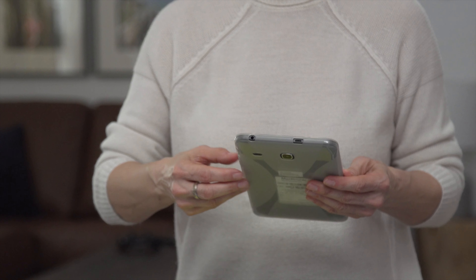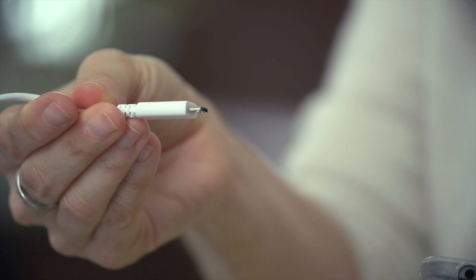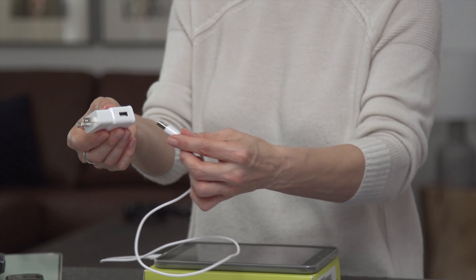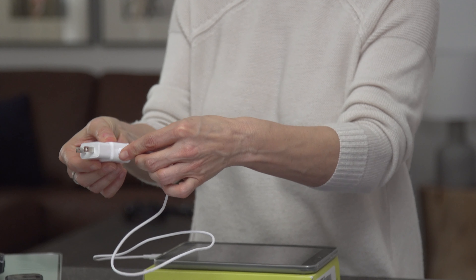You will want to charge the tablet before you start a health check. You will find the power cable in the same box as the tablet. Find the charger port at the top of the tablet and insert the small end of the USB cable into the charger port. Then insert the large end of the USB cable into the charging head. Once that's done, you can insert the charging head into any standard power outlet. It may take up to four hours to fully charge the tablet, but you can use it while it's still charging.